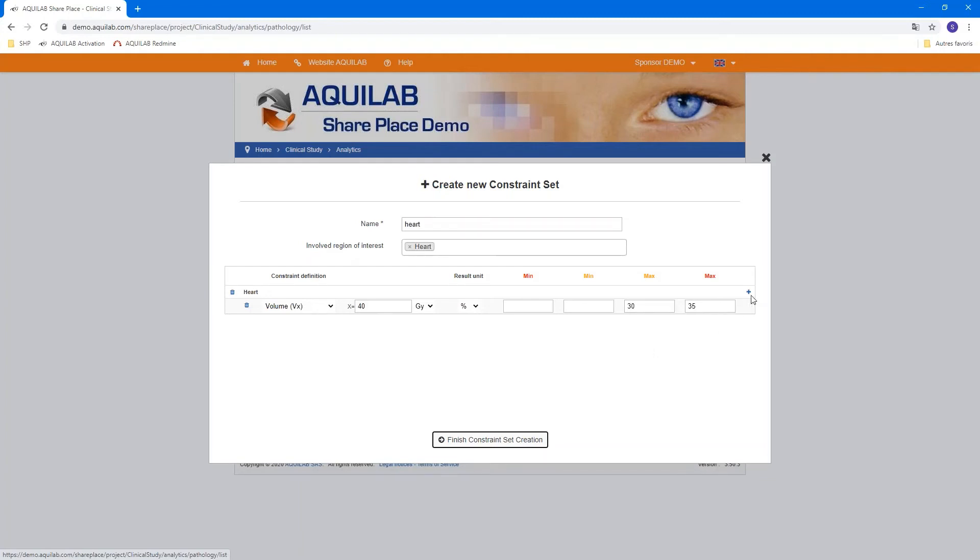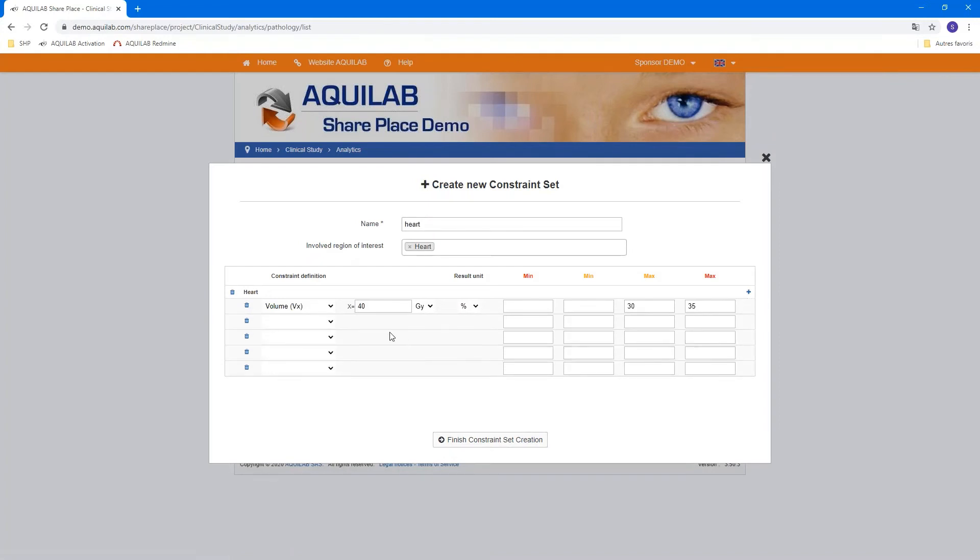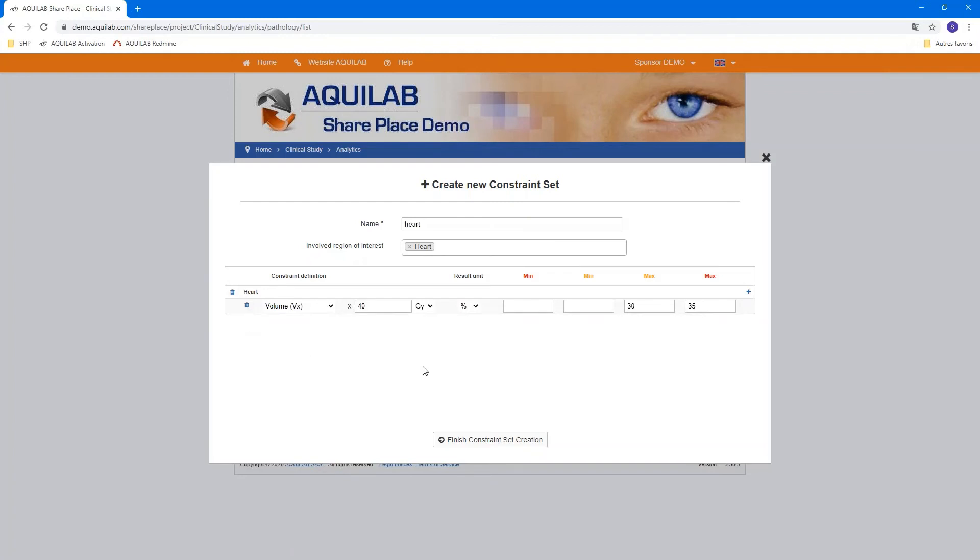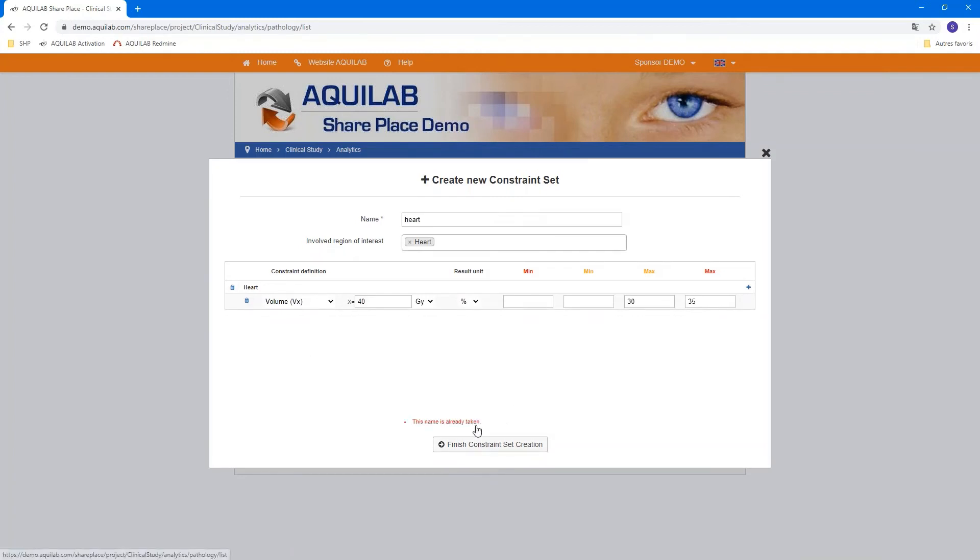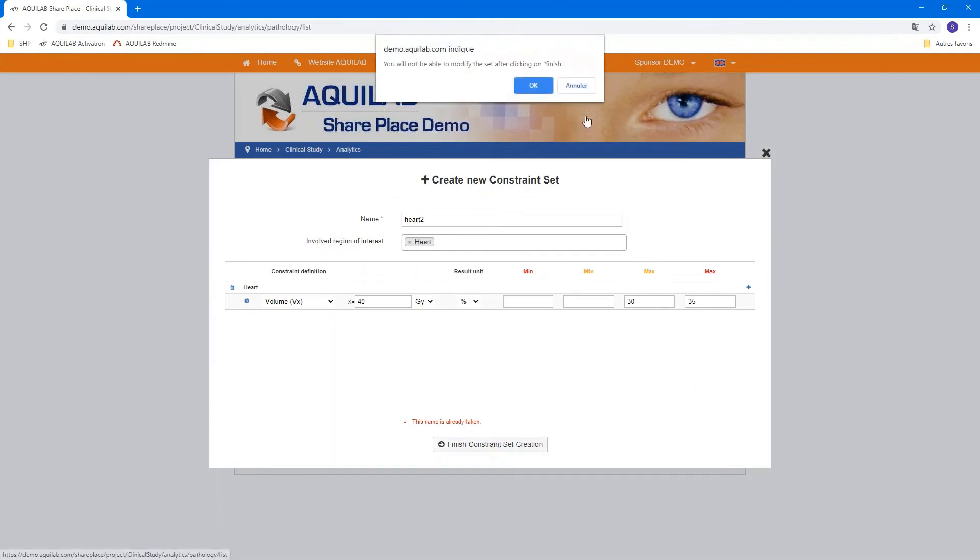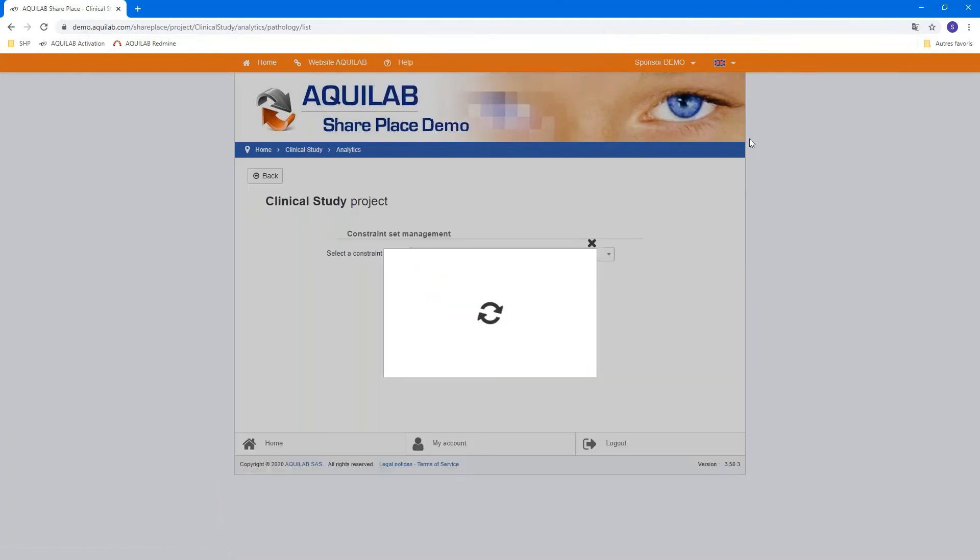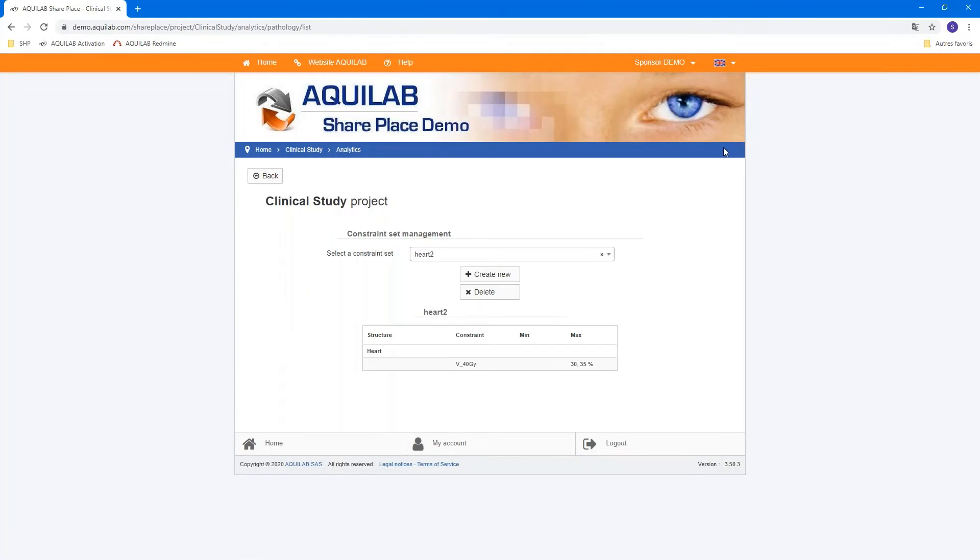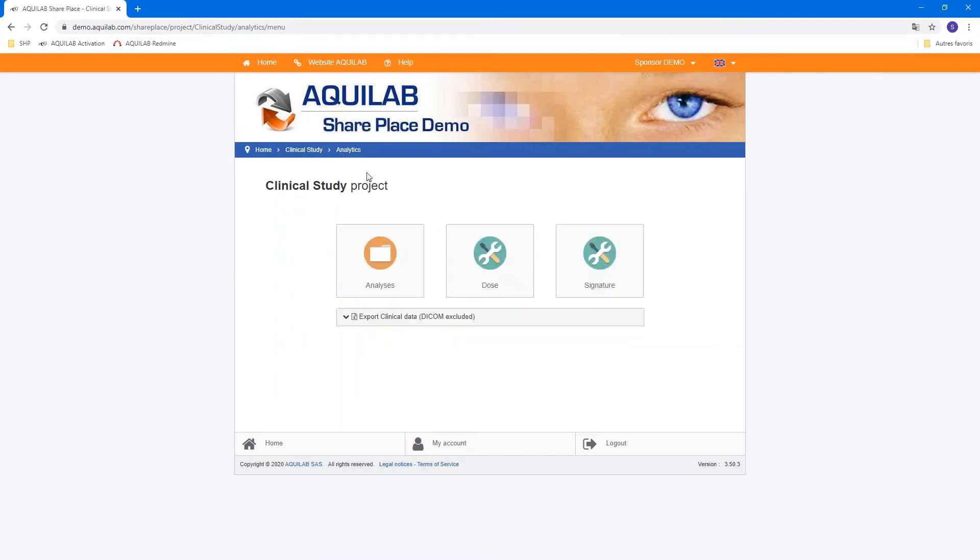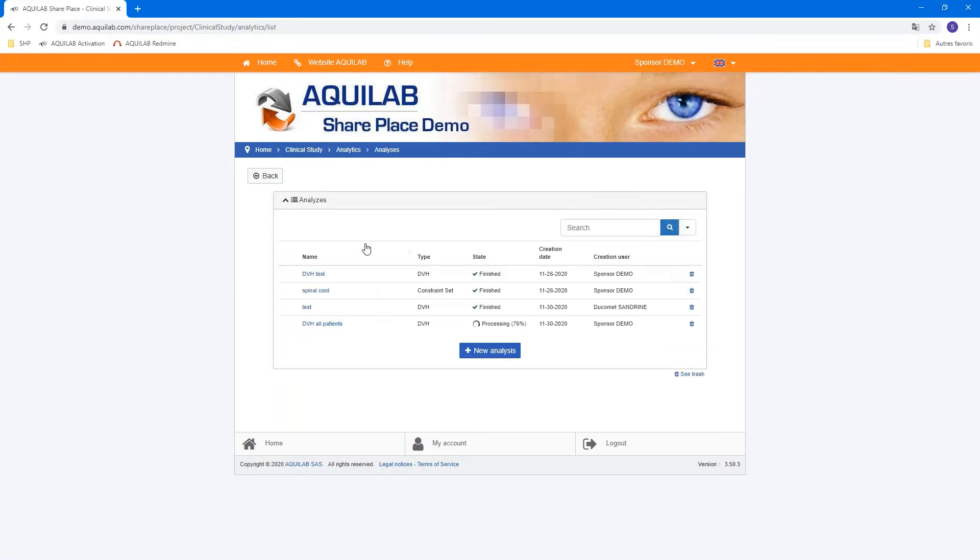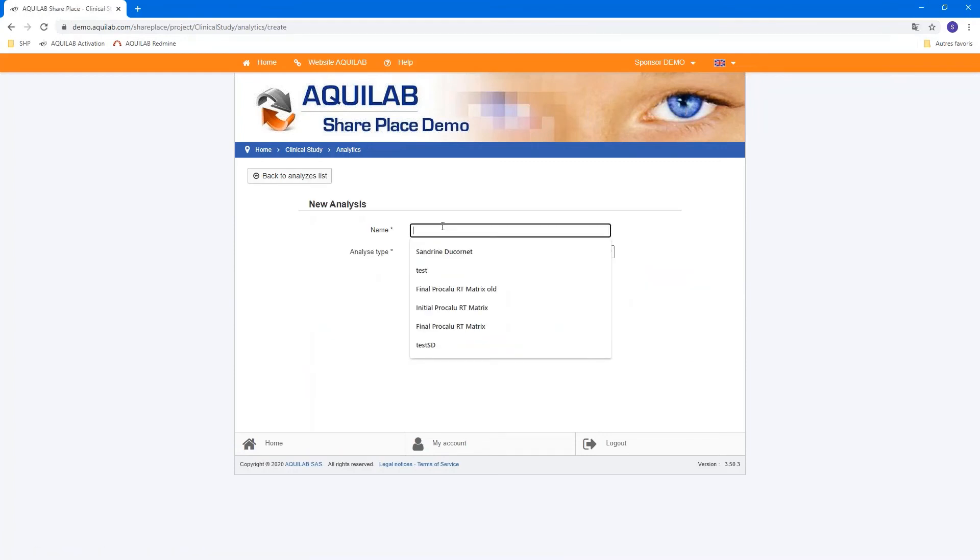You can add all constraints you need and all structure you need to add in this constraint set. And now we can create our constraint set. You can see the summary here. V40 and the constraint limit.